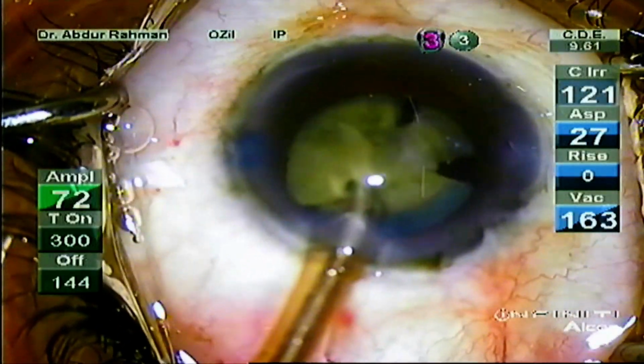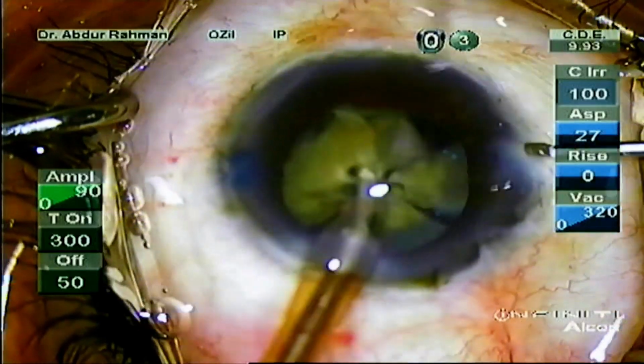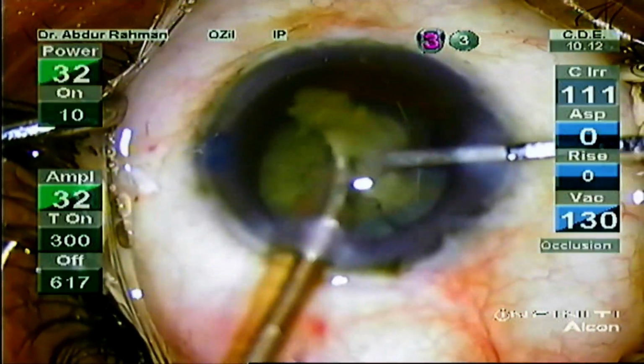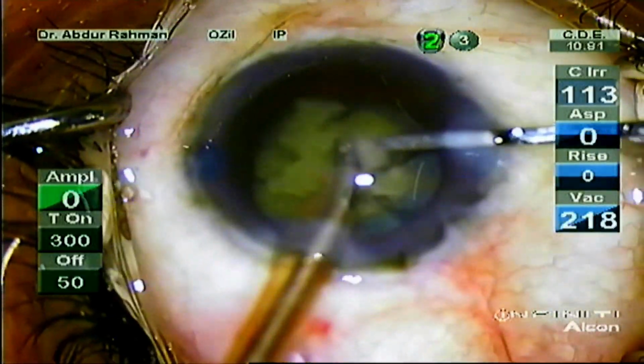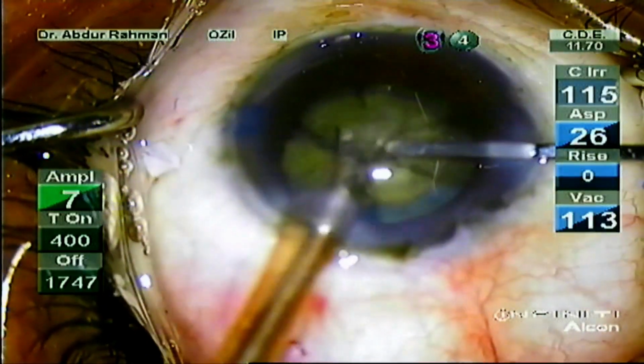See how I am emulsifying the chopped pieces at the iris plane. With the help of the spatula, guide the chopped pieces into the phaco handpiece and emulsify them easily.